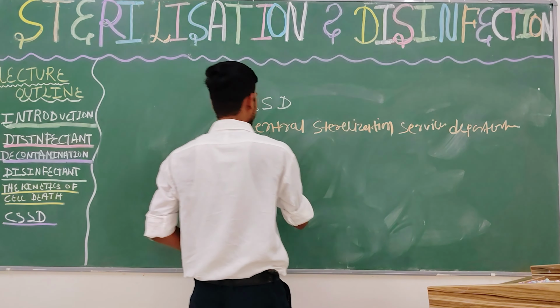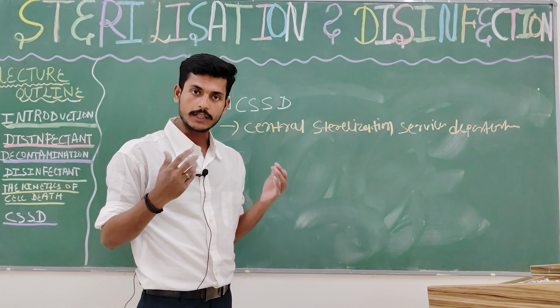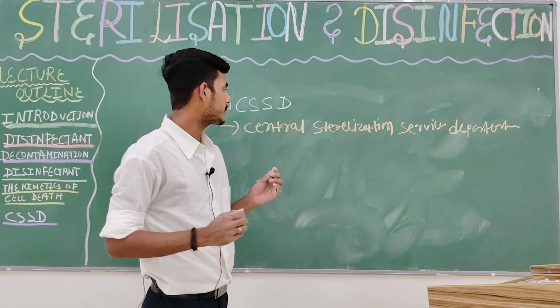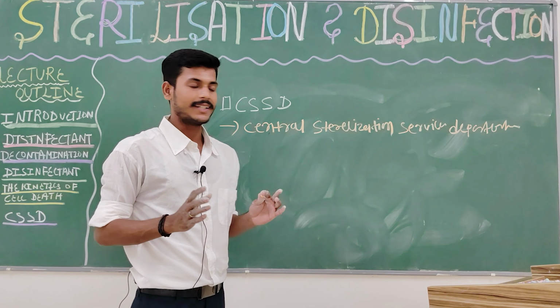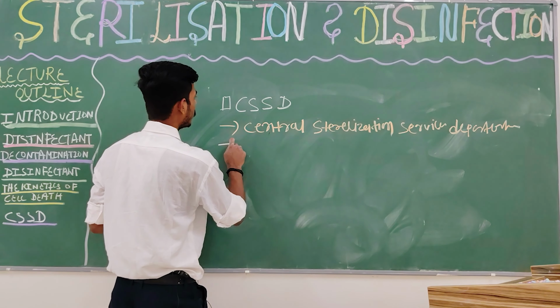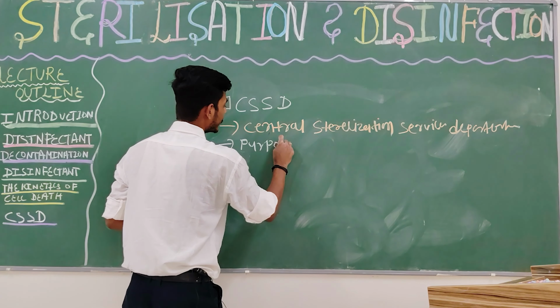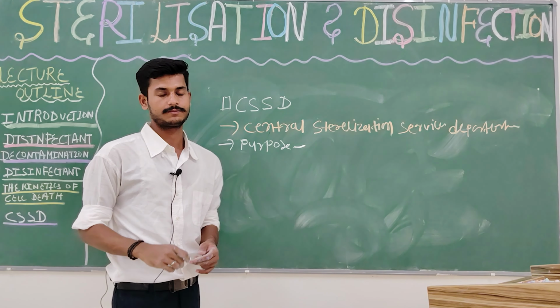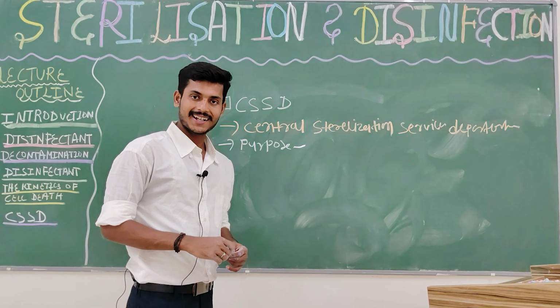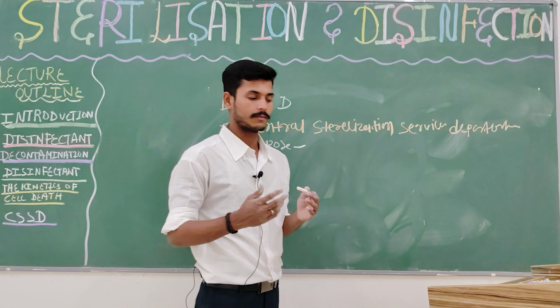Now, the Central Sterile Service Department is basically situated in the hospital setting. The purpose of this CSSD is to maintain sterile medical equipment.